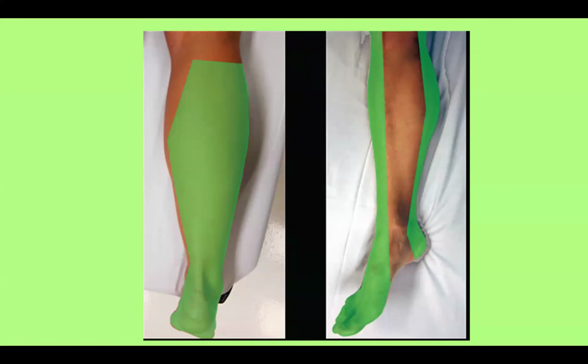So first up is the sciatic nerve block with the popliteal approach. The sciatic nerve is responsible for the majority of sensation and motor function, particularly below the knee. You can see highlighted in the green here will be the sciatic nerve sensory innervation. So if we need analgesia below the level of the knee, we're going to cover all of that section. The strip that's uncovered there is covered by the saphenous nerve, which we'll cover later, but it's a very handy block to know.